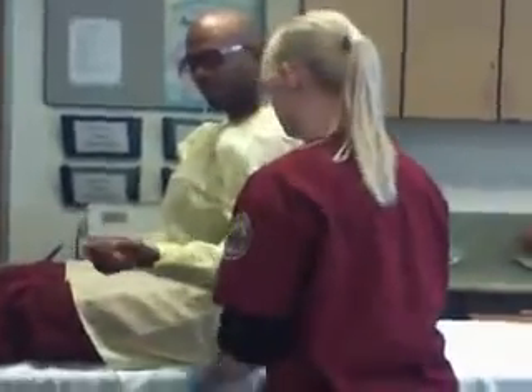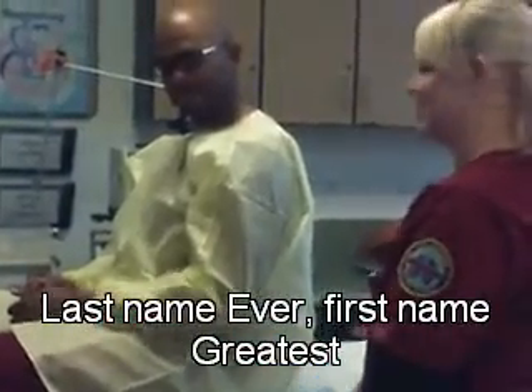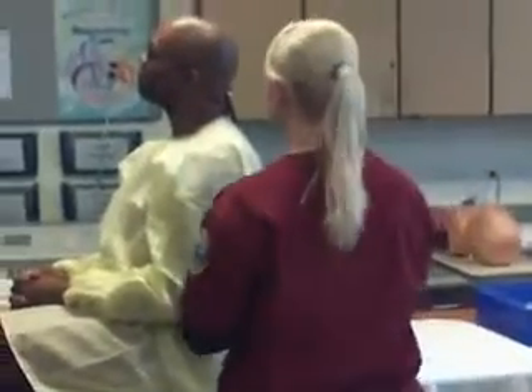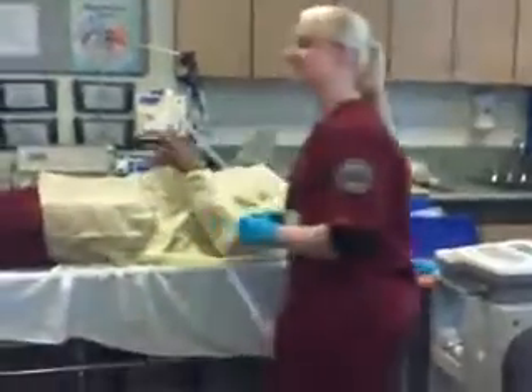Now check your name back. That's right. Next, Amanda's going to position the patient. "Sarah, can you please lay down?" And enter the patient information.